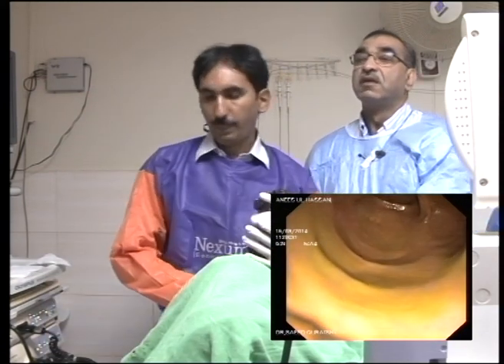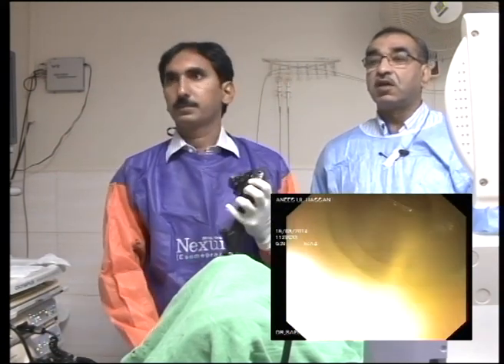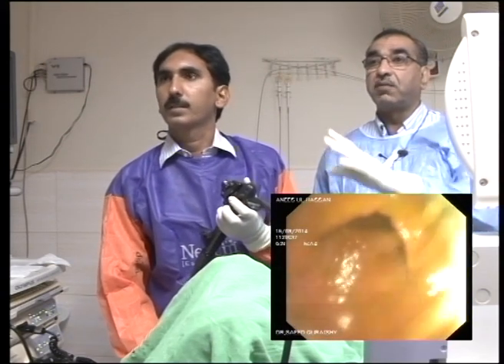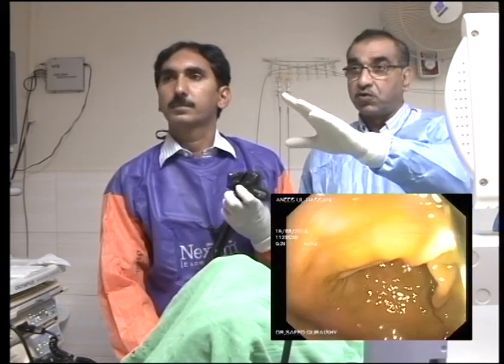Okay. Give it a clockwise torque. Just advance slowly, gently.